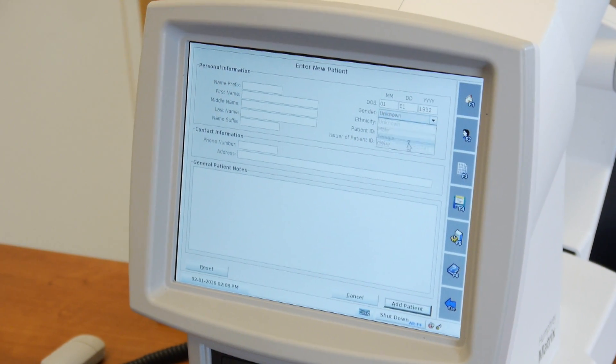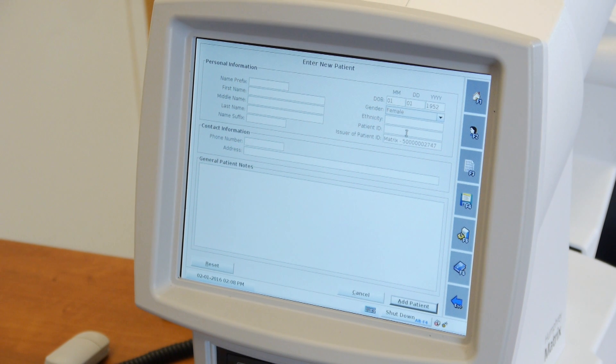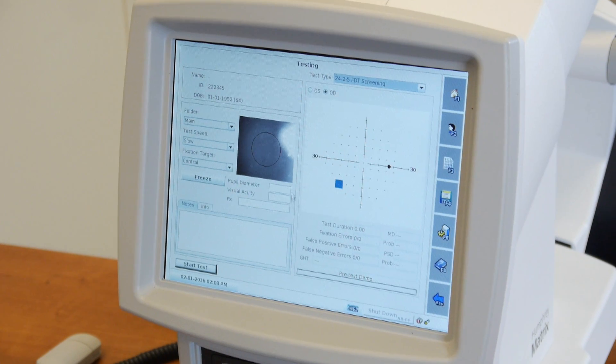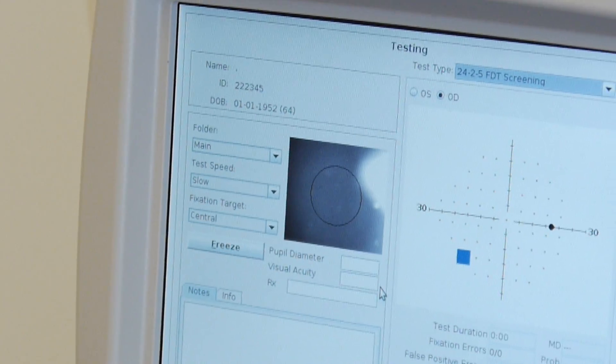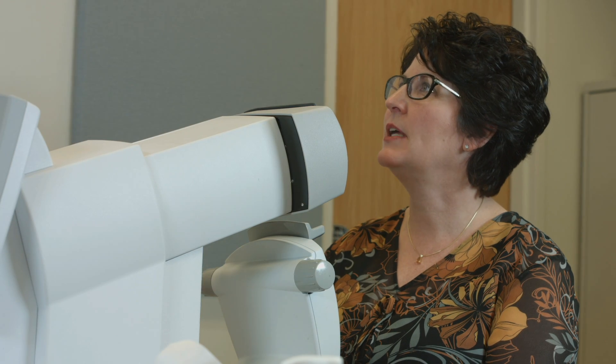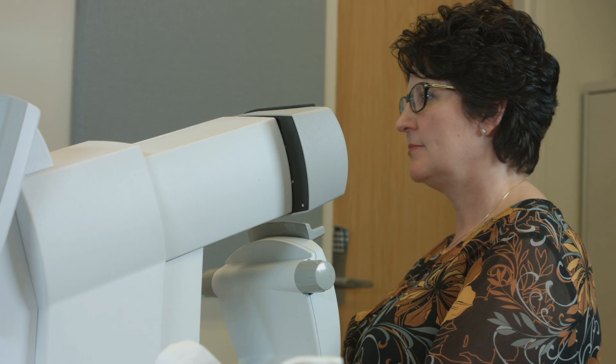Enter the gender and patient name. Click the patient ID field and scan the patient ID. Make sure the test speed is set to slow and the fixation target is central. Reminder: the patient can have their glasses on during the test.